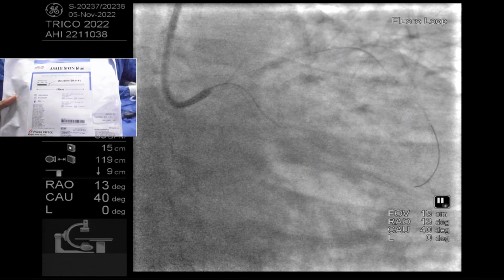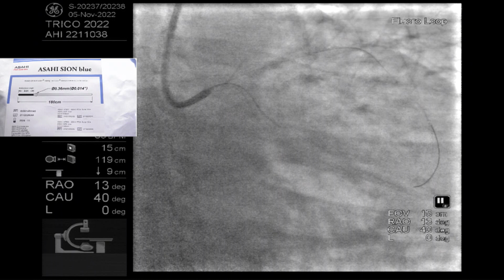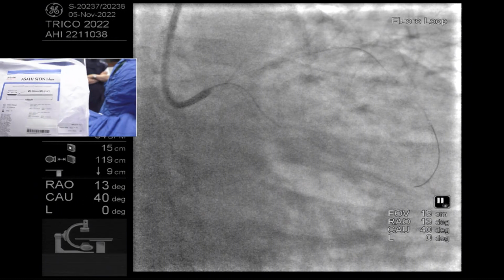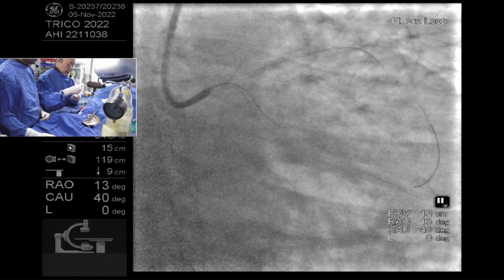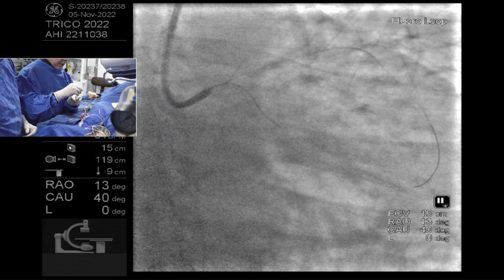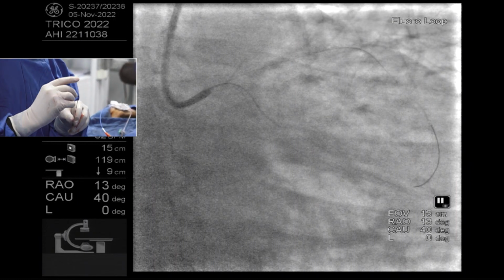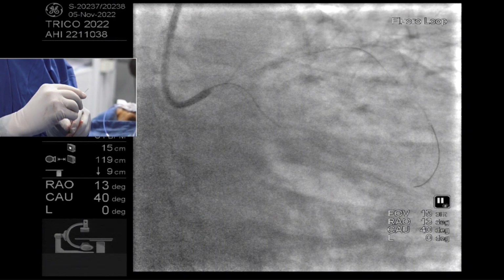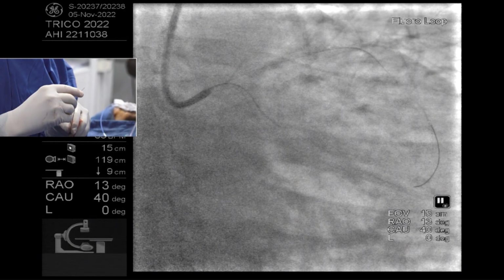Does anybody on the panel there ever use the reverse wiring technique with a single lumen microcatheter? I know most of the time we use a dual lumen to do that, but you can do some modifications with a single lumen. Sam or colleagues on the panel? Dr. Saito described it, I think, many years ago for diagonals with difficult ostium. My N is 1 actually, so I've used it once.